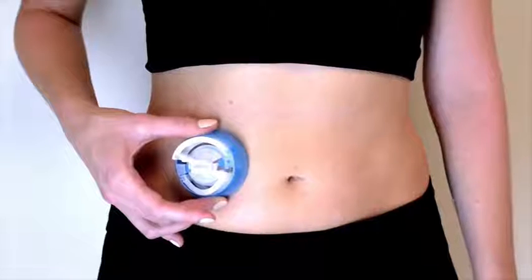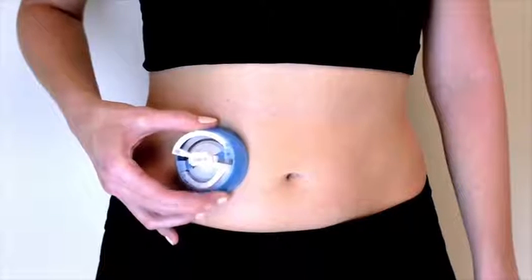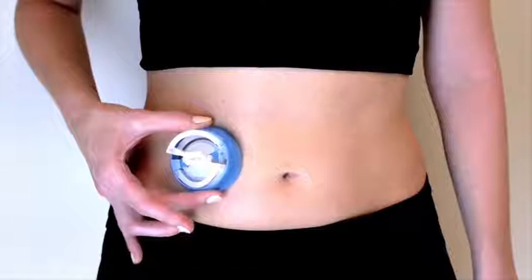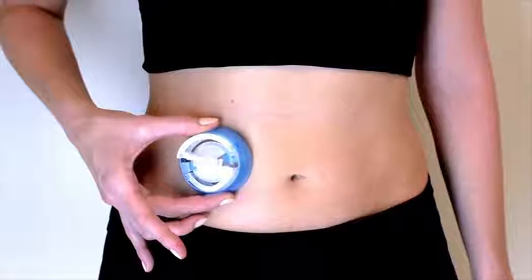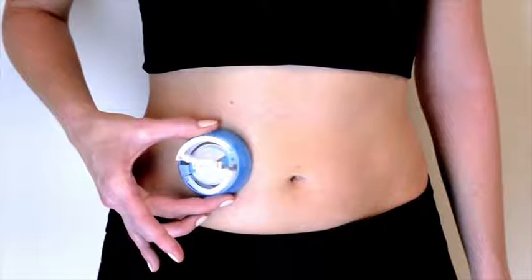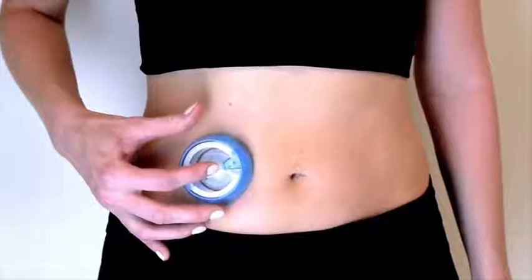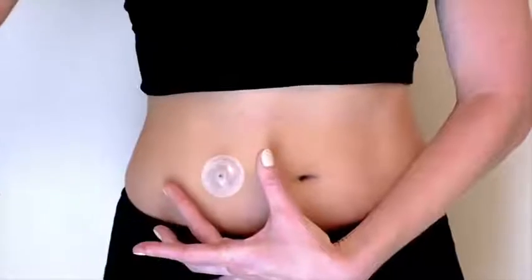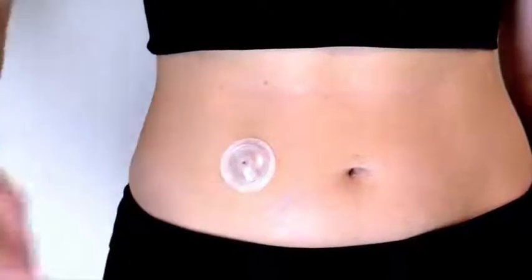To apply, hold the insertion device against your skin over the site you have prepared. Locate the round indentations on either side of the device. Once your fingers are in position, squeeze simultaneously to insert the injection port. Press down on the center of the insertion device to secure iPort Advance to the skin and then gently pull the insertion device straight out. Smooth down the adhesive to secure it to your skin.